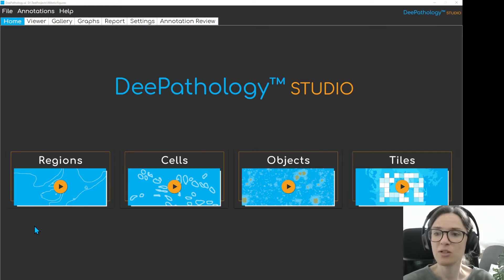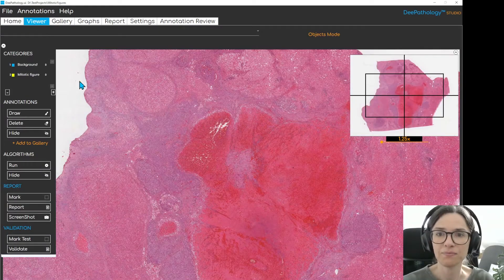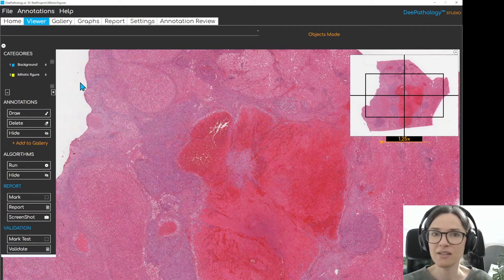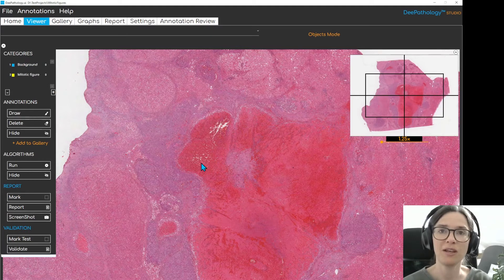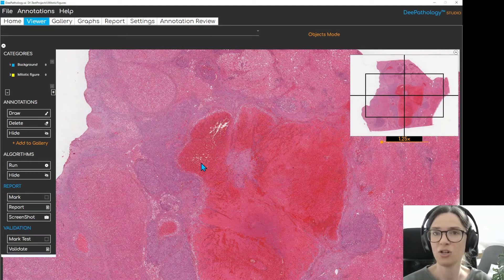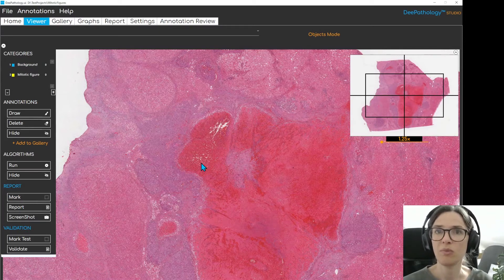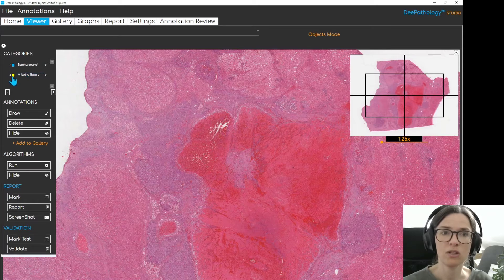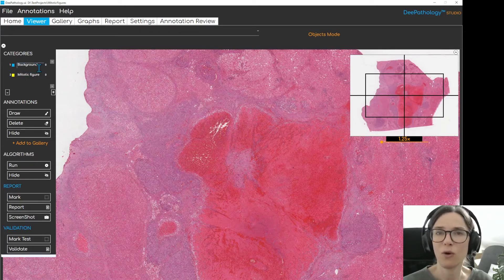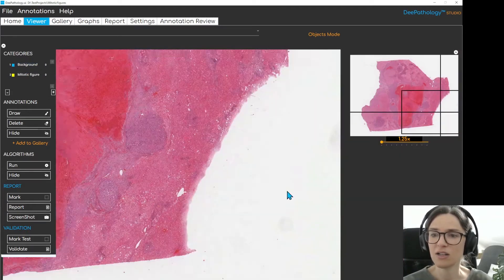The first step is always to create a new project, this time in the objects mode, and add one or more slides. I've already done this, so today we'll be working on a slide obtained through TCGA, the Cancer Genome Atlas project, belonging to a 50-year-old patient with hepatocellular carcinoma. I have also prepared the categories: mitotic figures and background for everything else we're not interested in. So now we are ready and we can get started and annotate.